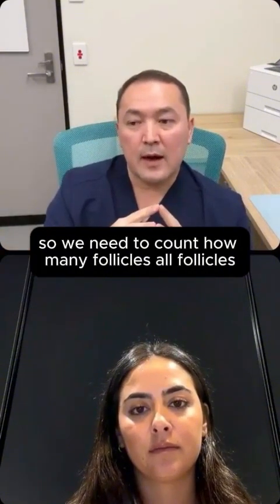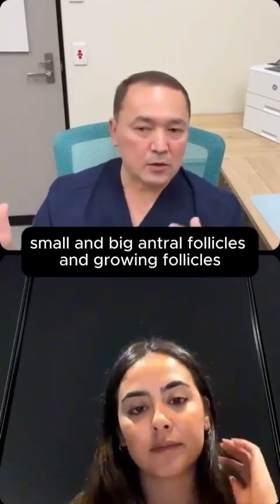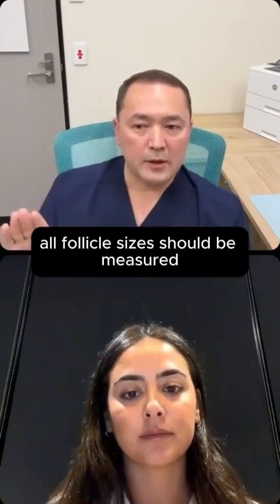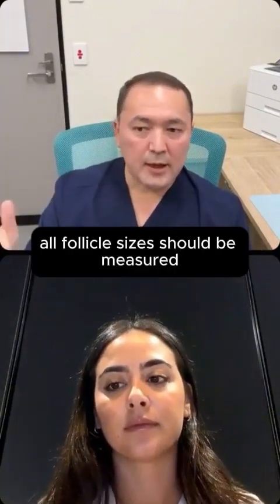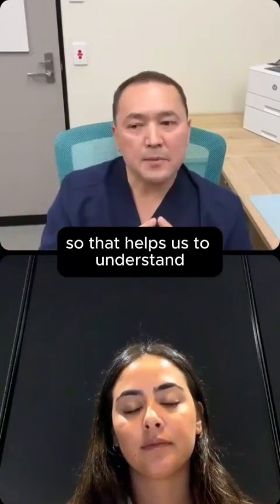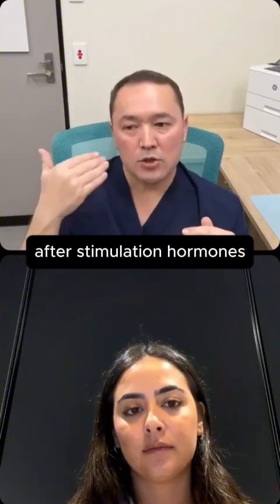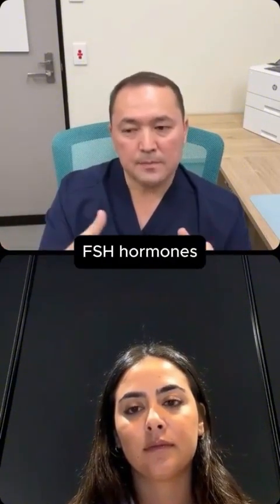So we need to count all follicles, small and big, antral follicles and growing follicles. All follicle sizes should be measured and then we plot them on the chart, on the right and left ovary. That helps us to understand how many follicles got activated after the stimulation hormones, the FSH hormones.